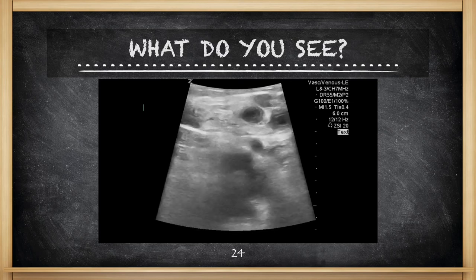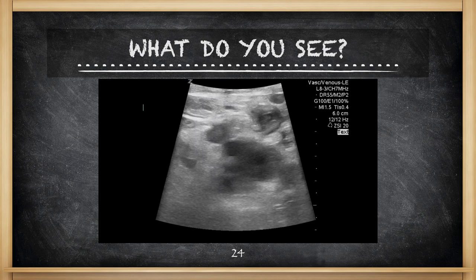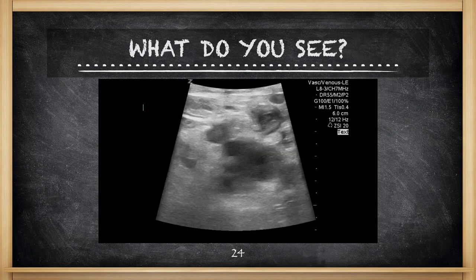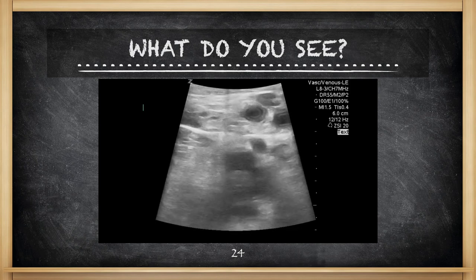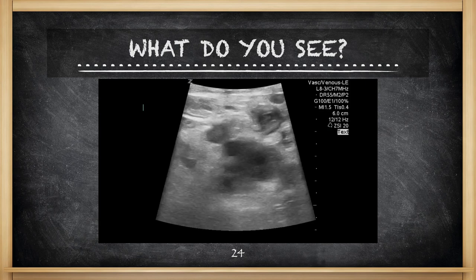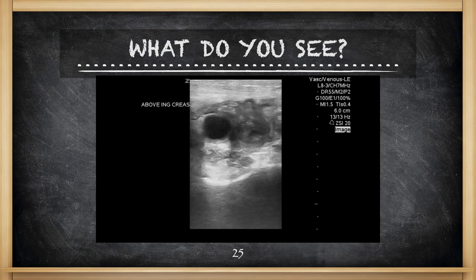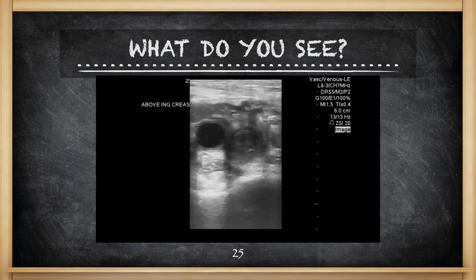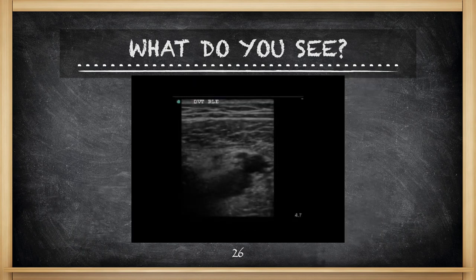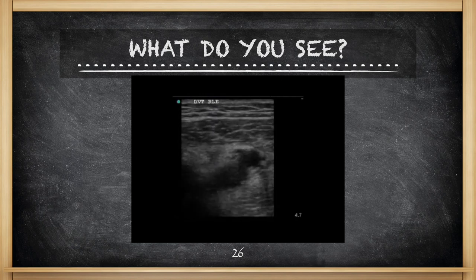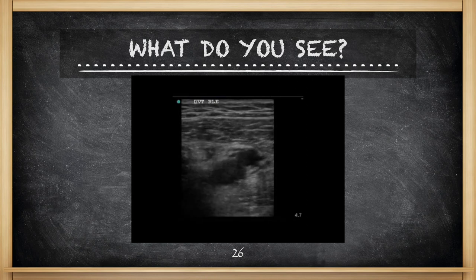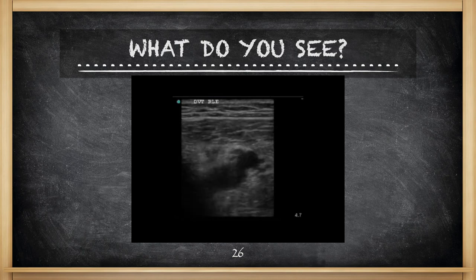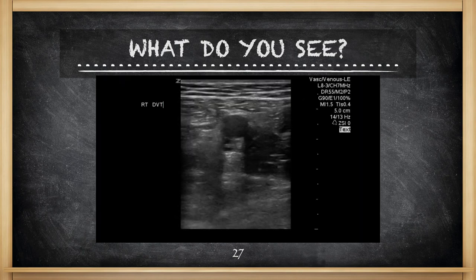When you look at this image, you can see an echogenic area that is non-compressible, with actually two parts that are non-compressible. Your artery to the left-hand side is also not compressible. As you migrate down, that echogenic focus becomes even more prominent — it almost looks like a sandy snowman standing on top of himself. In the next image, you see a blood vessel on the right-hand side which is minimally compressible, and then a hypoechoic circle deep to that. This is one of your femoral veins in the mid-thigh because it's behind the artery, and this is concerning for a DVT.